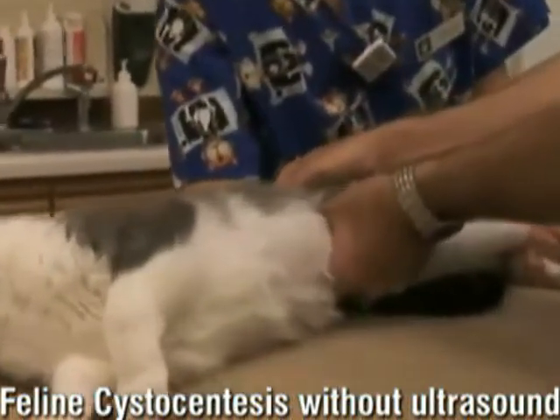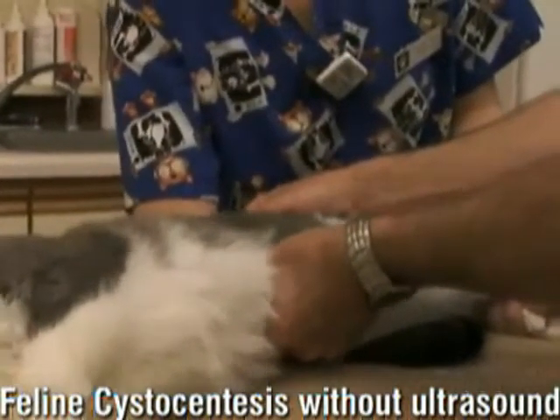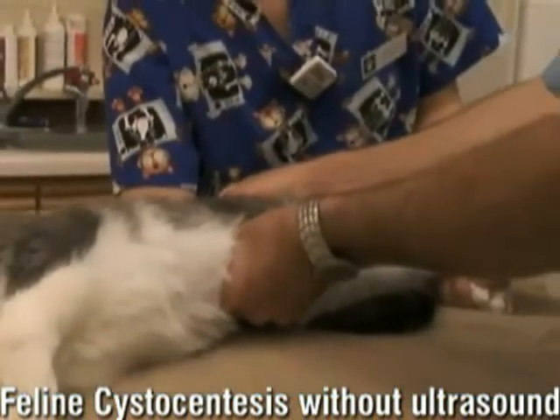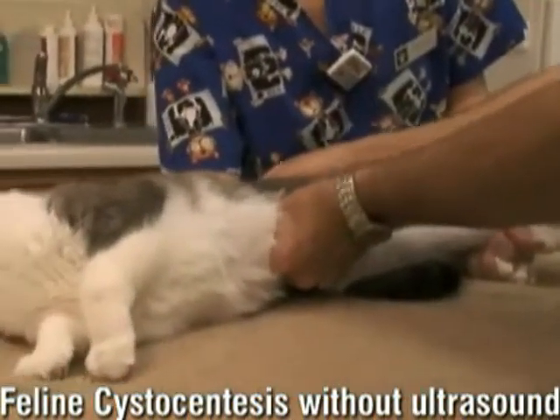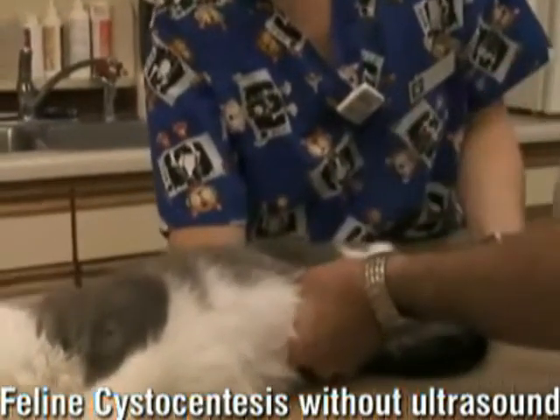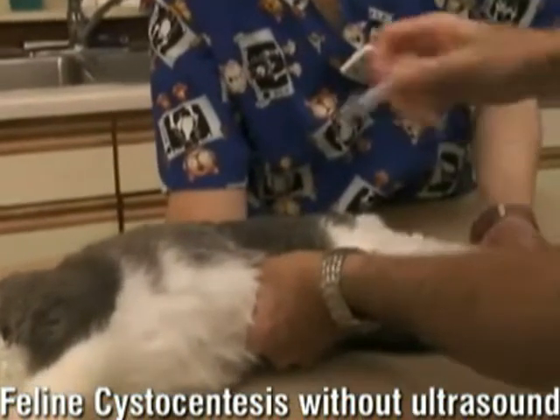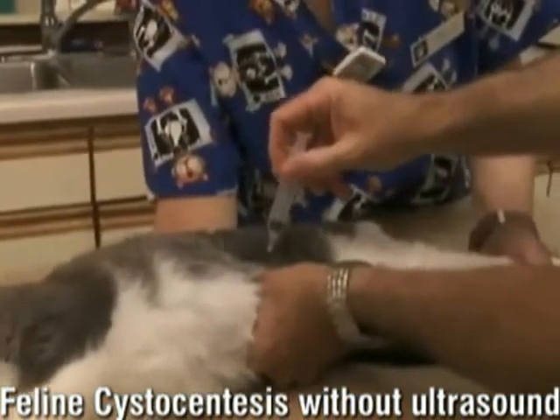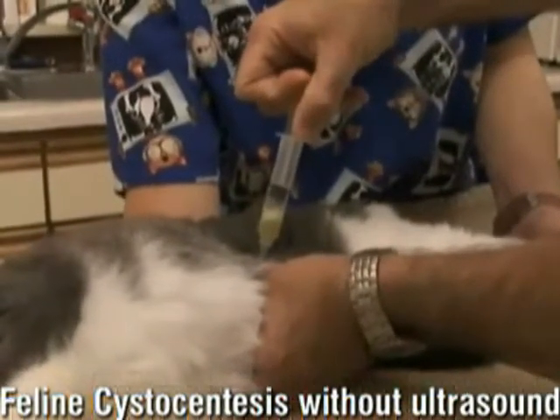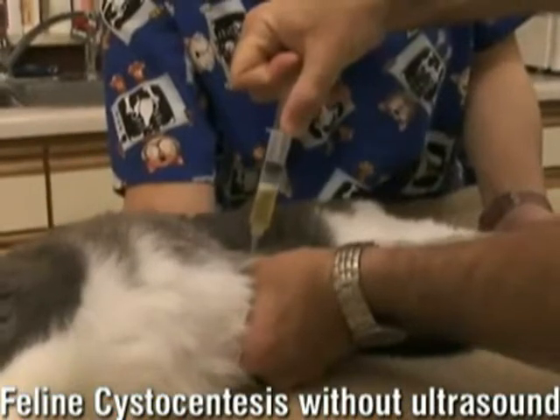So urine collection on the cat without ultrasound is what we're going to do right now. Angelina, if you'll stretch Riley out here — we're going to do a regular old cat stretch. We like them in lateral recumbency like this instead of on their back. Then what we'll do is just palpate the bladder right back in this area. Usually in the cat, if the bladder is pretty full, it's not too hard to feel. It's a small bladder, but we're going to give it a shot.